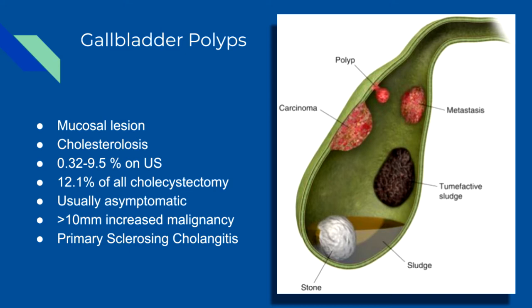Sonographically, you'll see an echogenic round lesion adherent to the gallbladder wall, and they will not have shadowing. There are two types: benign, with cholesterol being the most common.